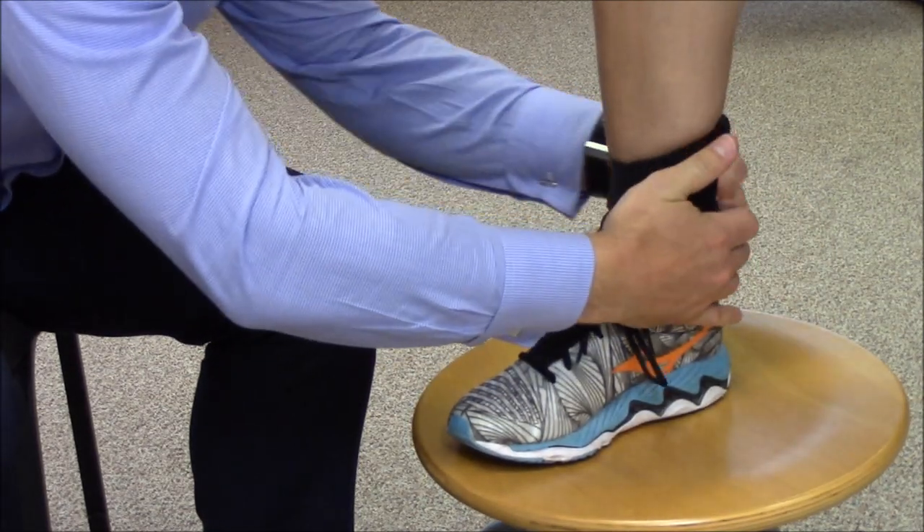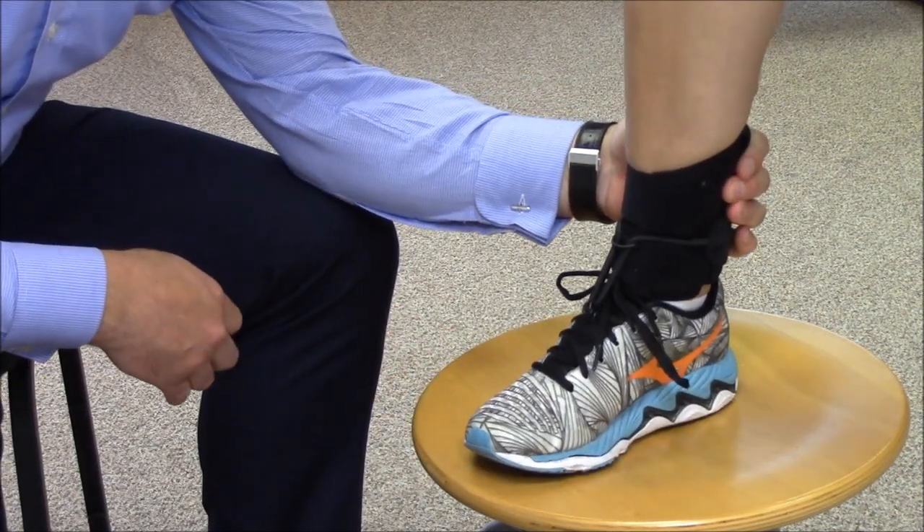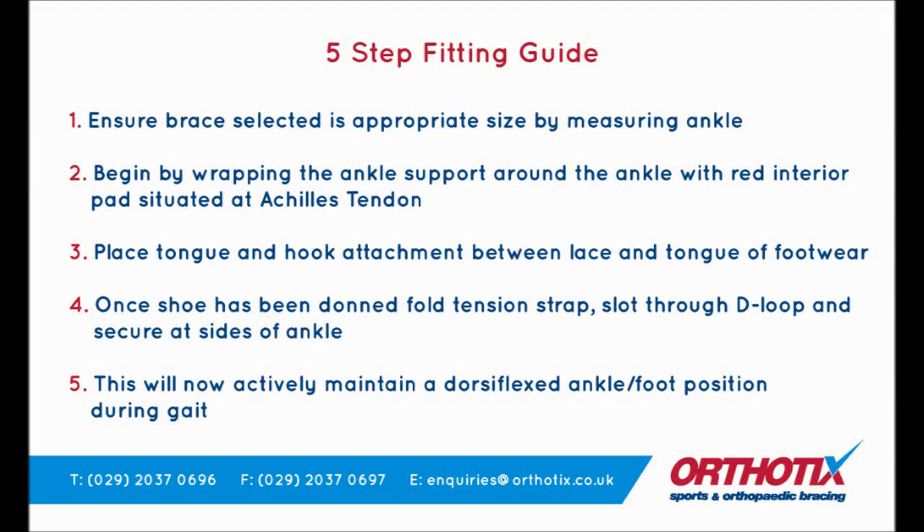Once you are confident that all fastenings are secure, check that the foot is held at plantar grade and that the user is comfortable.